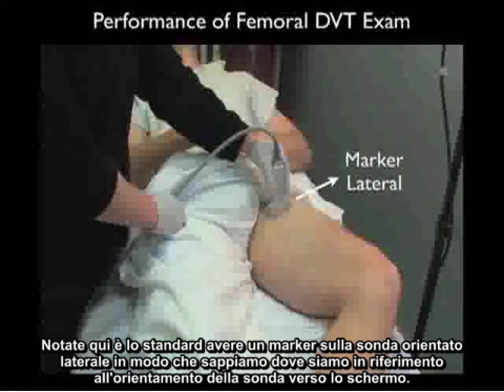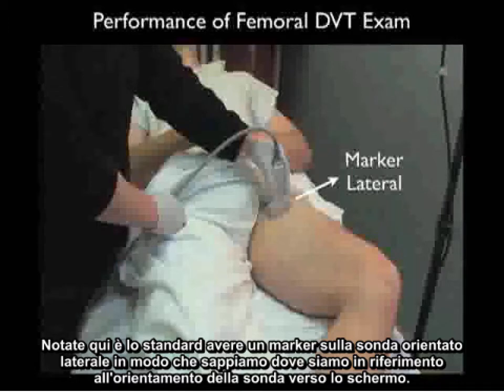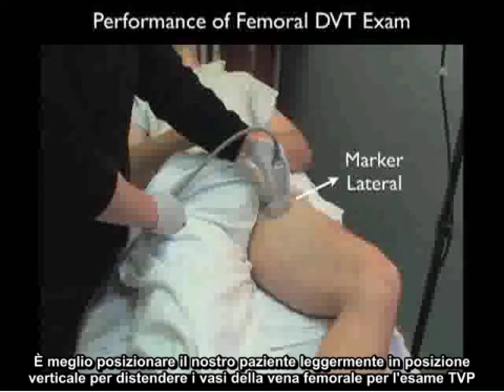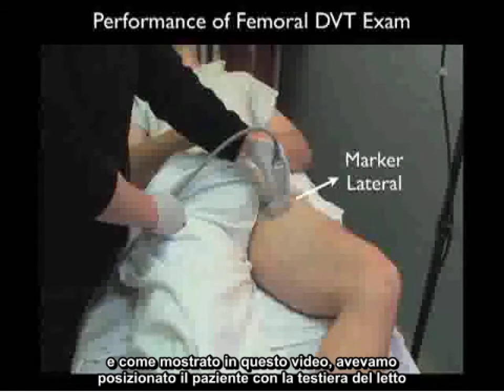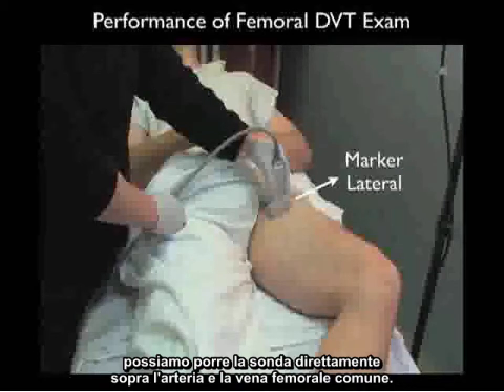Notice here it's standard to have the marker on the probe going lateral so that we know the orientation of the probe versus the screen. It's best to position the patient slightly upright to distend the femoral vessels for the DVT exam — as shown in this video, the patient had the head of the bed up about 30 degrees. We also want the leg slightly externally rotated so that we can place the probe directly over the common femoral artery and vein.